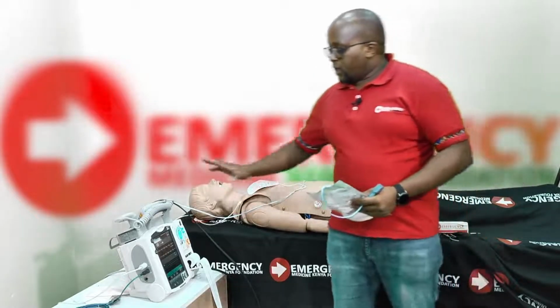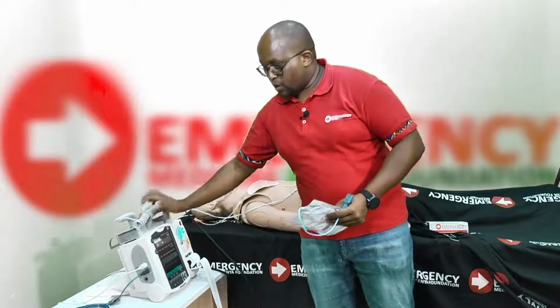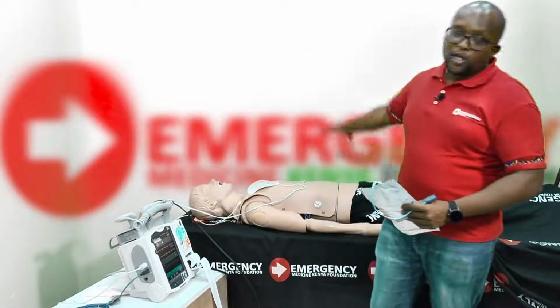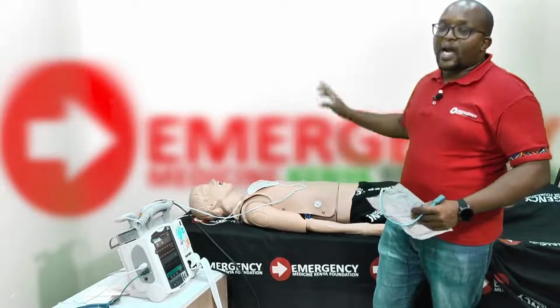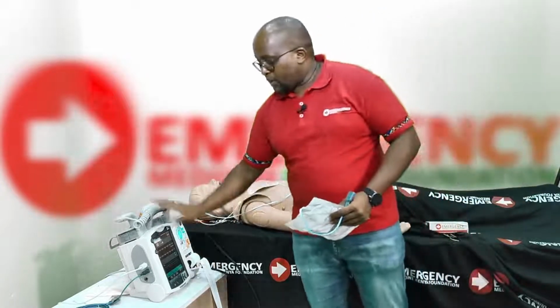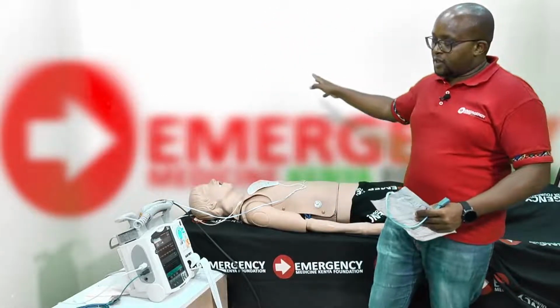And then the machine that came with the patient, put it on demand mode. Put the machine that brought the patient on demand mode. Then in your departmental machine, put it on fixed mode. Put a heart rate higher than what our patient here is currently at, 80 beats per minute. You can put yours at 85 or 90 beats per minute.